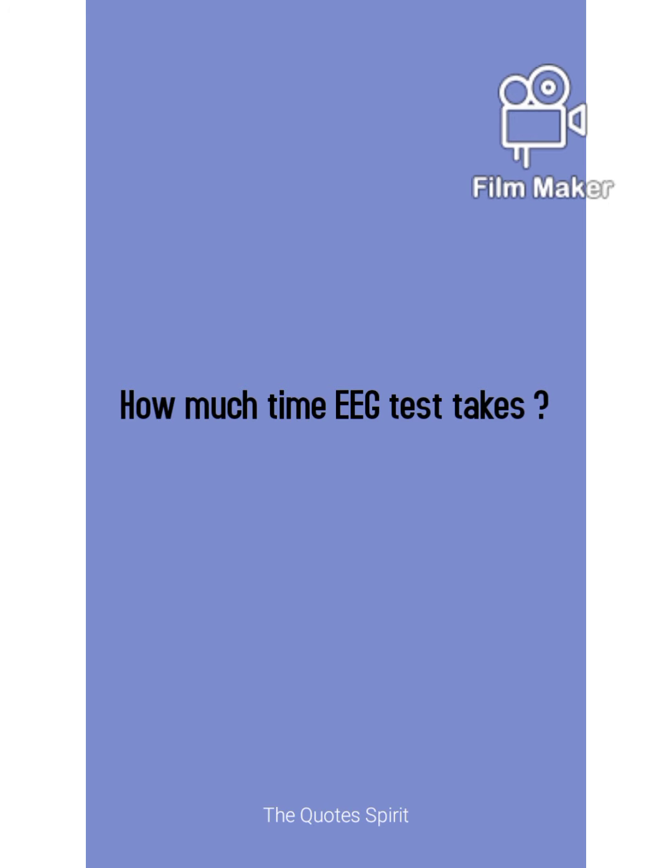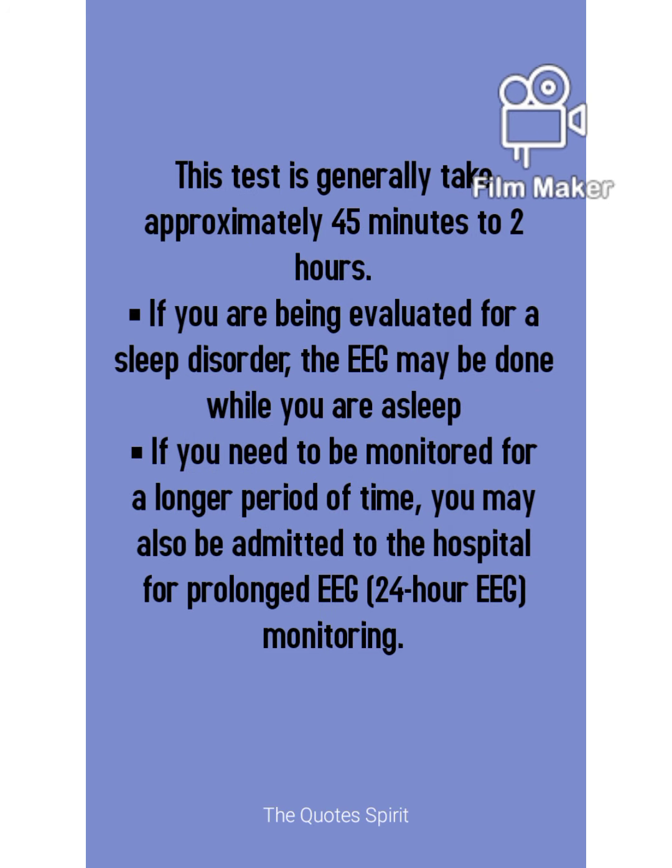So now let's see how much time an EEG test can take. This test generally takes 20 to 45 minutes, or 45 minutes to 2 hours. If you are being evaluated for a sleep disorder, the EEG may be done while you are asleep at night.